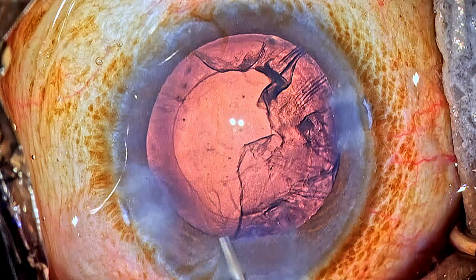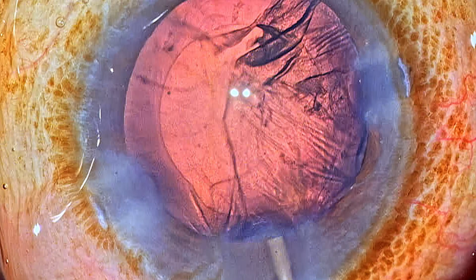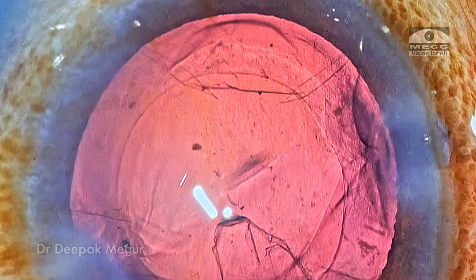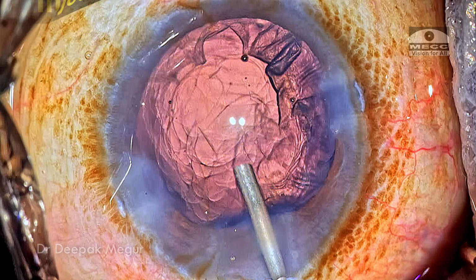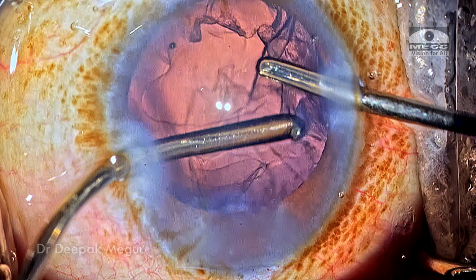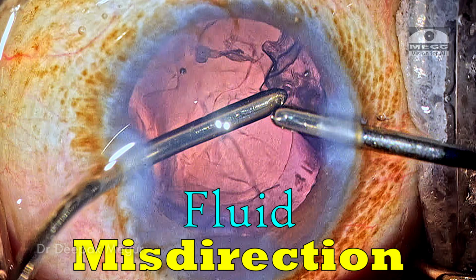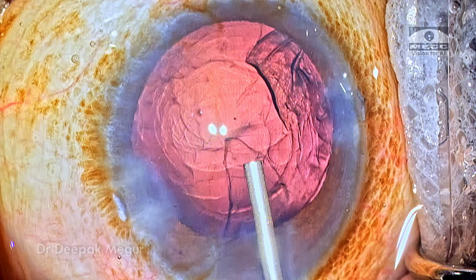So to summarize, posterior capsule wrinkling and trampolining of the posterior capsule is an important sign of posterior zonular weakness, and this has a clinical implication: if you don't recognize this and take adequate measures during cortex aspiration, like keeping the bag formed with viscoelastic, there is a higher risk of causing a posterior capsule tear, because invariably we're also going to have positive pressure because of the fluid misdirection which can happen because of the compromised zonules, and the PC is always pushed forward.